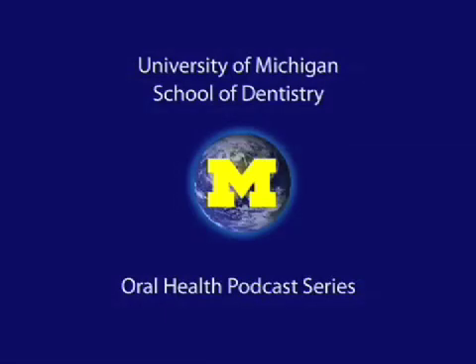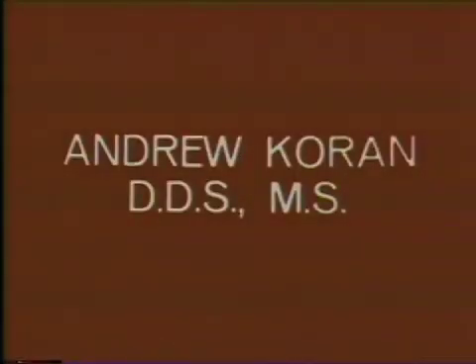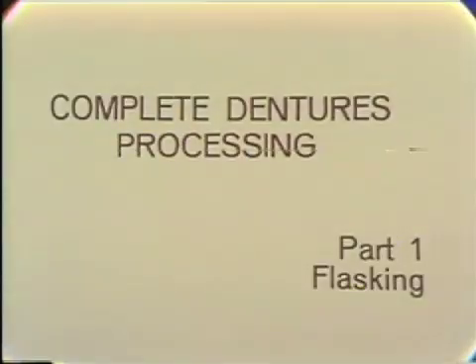Welcome to the University of Michigan Dentistry Podcast Series, promoting oral health care worldwide. In this demonstration, I will be flasking a maxillary and mandibular denture in preparation for processing the complete denture.